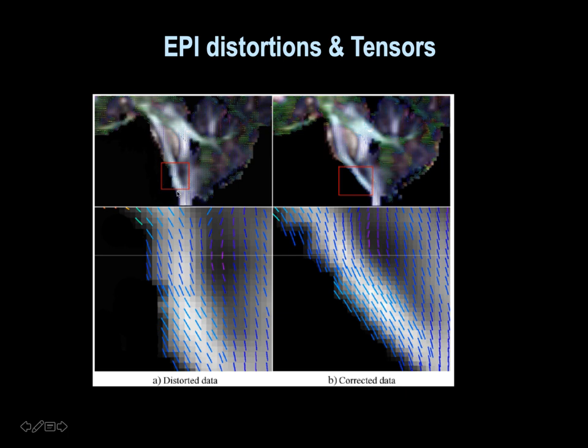So here is essentially a sagittal reconstruction of a diffusion tensor field on distorted images. And if you follow the direction of highest diffusivity from which you can do tractography, you can see that if you start here, you tend to go toward the back of the brainstem when you are down there, okay? So in this, you are not really following the corticospinal tract faithfully.